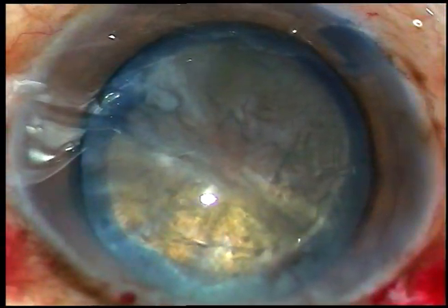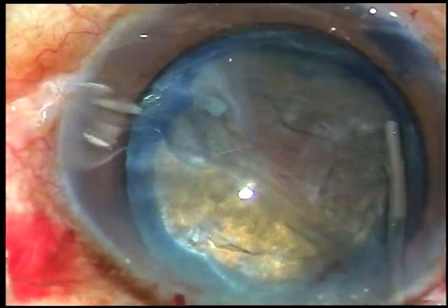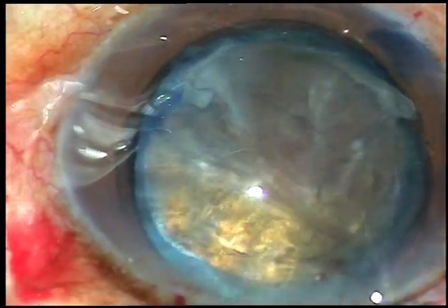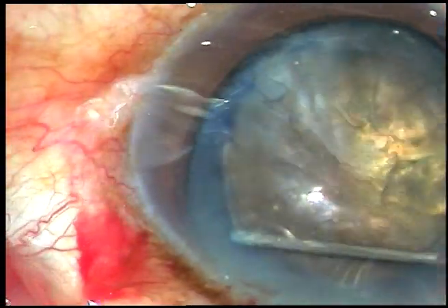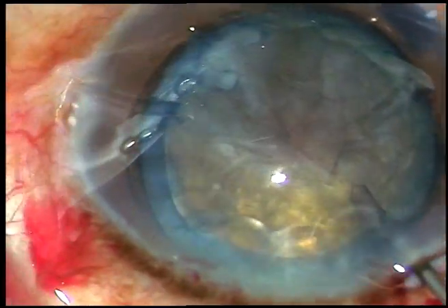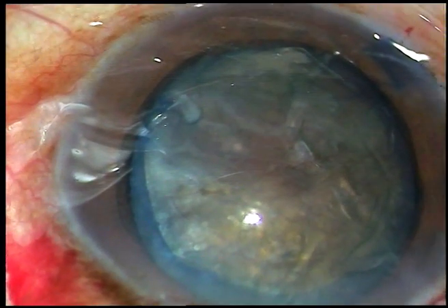Now hydrodissection is to be done. In this case, I am going to do hydrodissection at two points — at 8 o'clock and at 2 o'clock. I gently tap the nucleus and I see that the nucleus is free and it is rotating.